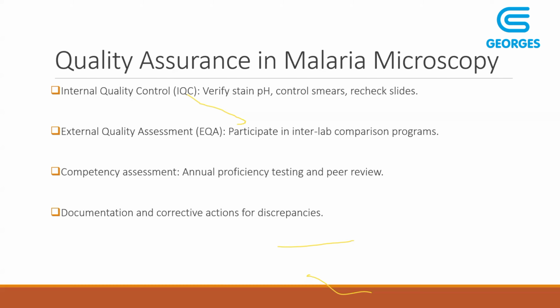And then we have the annual competency or annual proficiency testing and peer reviews. And then documentation and corrective actions for discrepancies in malaria identification programs.